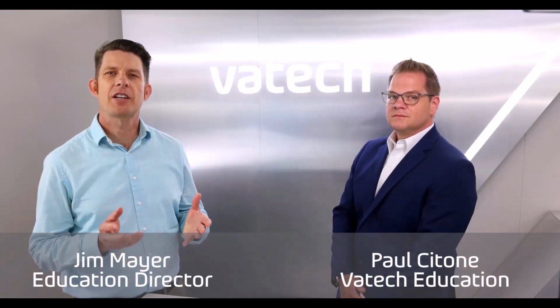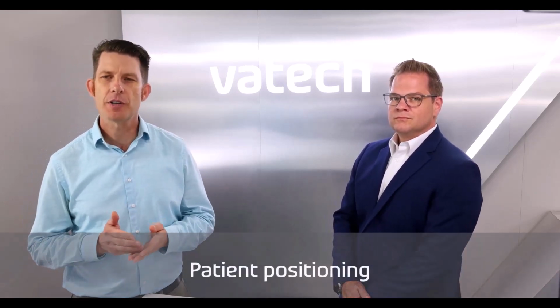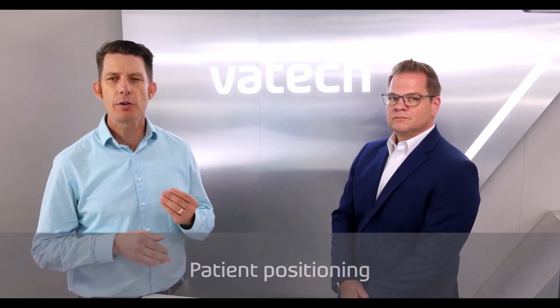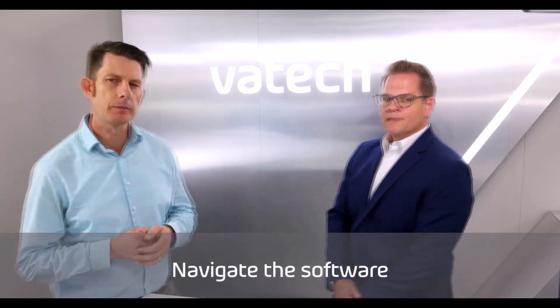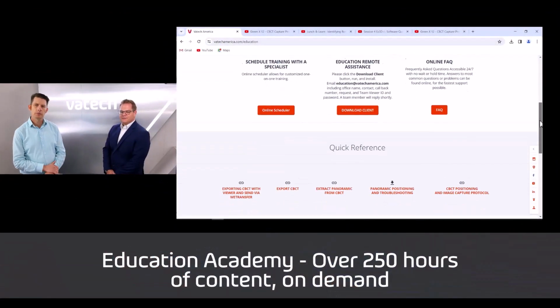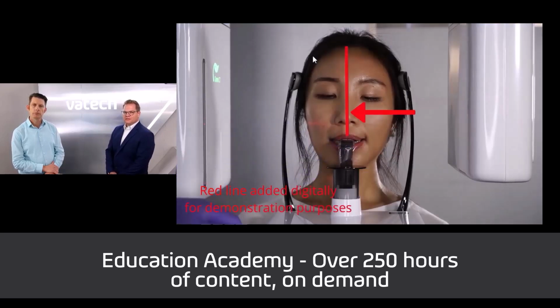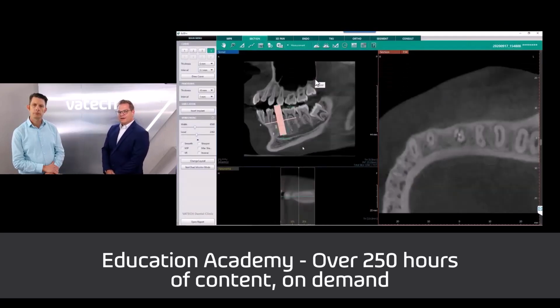Welcome to your Vatech education experience. At the conclusion of today's sessions, you will understand the available modes for your new Vatech device, be able to accurately position patients, resulting in high quality images, and also efficiently navigate the Vatech software. In addition to this training session, Vatech America has created a customized educational experience for you. The Vatech Education Academy has over 250 hours of on-demand content right from our website. We broadcast weekly 20-minute lunch and learn sessions on various clinical topics and ongoing training sessions customized for you.